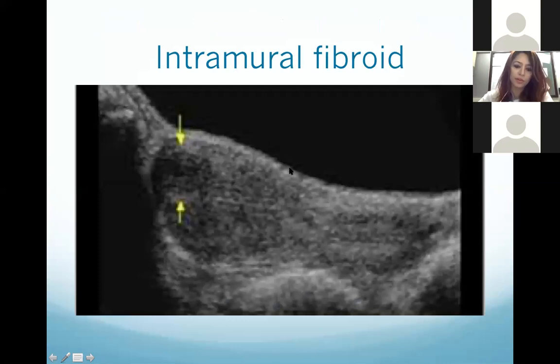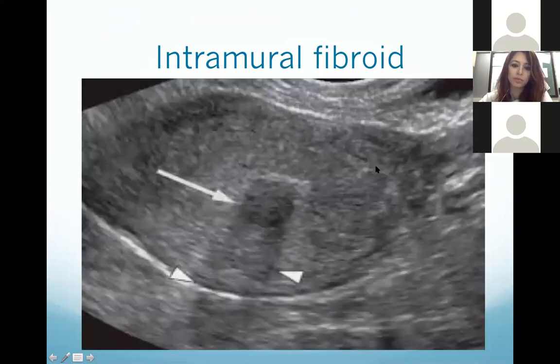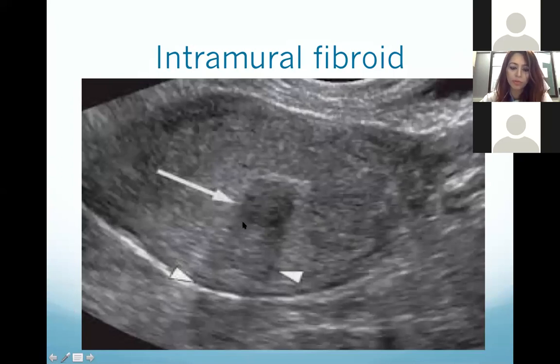Here you can see an ultrasound image of a uterus. This black area is an intramural fibroid in the region of the fundus. This is another image of the uterus — this is the endometrium, the white line — and this round black area is an intramural fibroid within the myometrium.